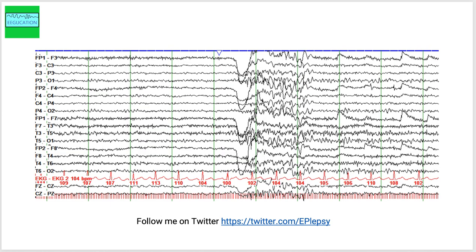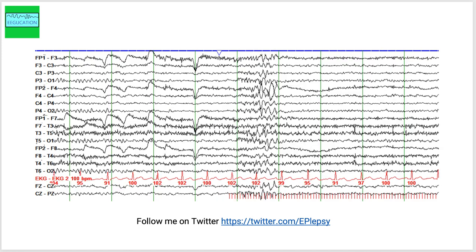This is another page from the same patient and you see the photoparoxysmal response. I will give you some better examples with higher amplitude spike and wave just after a few slides here. These are all examples of, as soon as you start the stimulation, you see the change on the EEG right here.